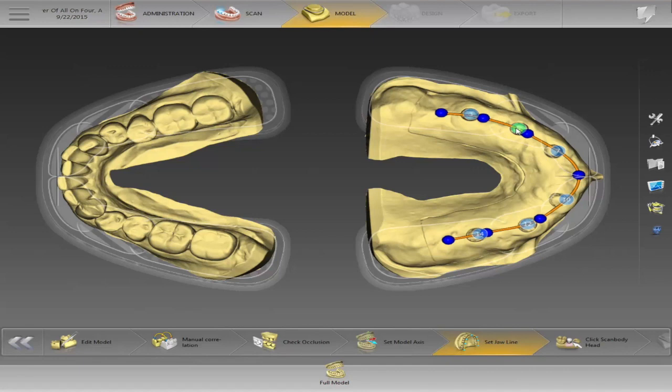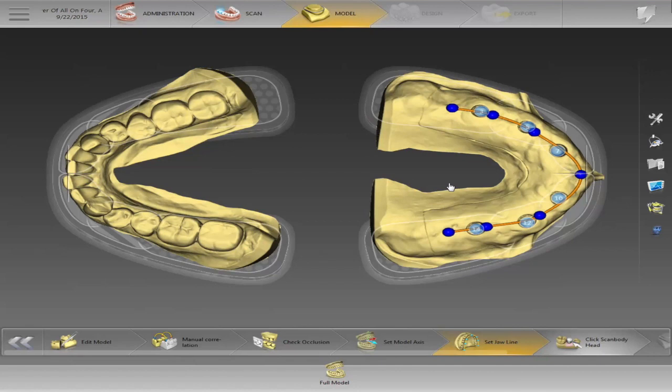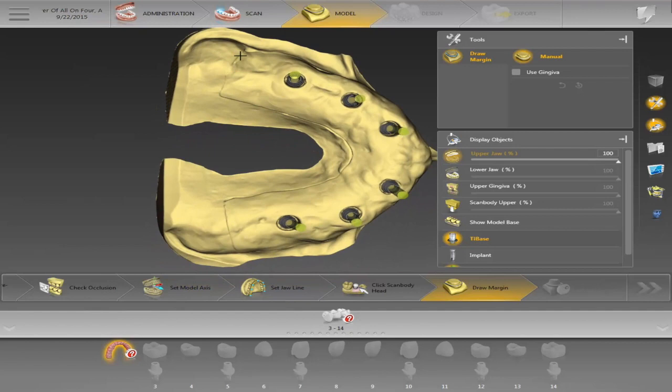I'll place all the numbers where they belong. On this section when you click on the scan bodies, normally it finds all the scan bodies for you — it goes to, say, number 3 and already found it. If it didn't, it would have a little question mark under the implant. I just like clicking on them to confirm each implant goes with the right scan body, so I double-click each one just to make sure — I don't want to have to redesign a case.